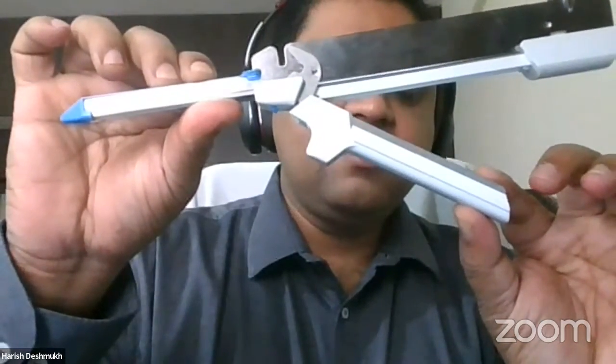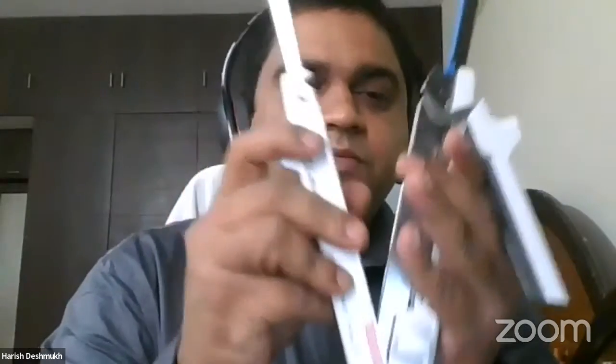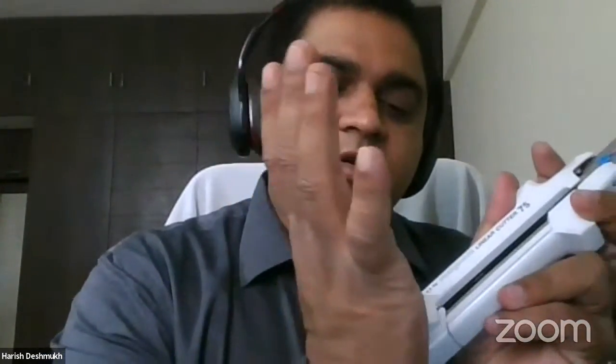This is the firing handle, and this is the closing handle. The closing handle should always be open during this time. When you're applying it to the tissue, align the proximal end, drop it, then close the handle. For firing, use the firing knob, and use the palm to fire it because we use titanium alloy. The force to fire titanium alloys is always higher, which I showed you with the molecular structure of it. So always use the palm.